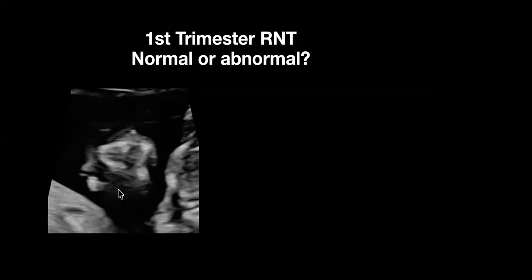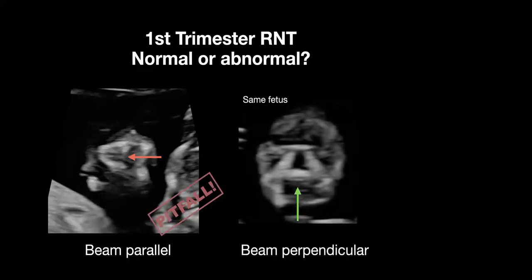And here it's kind of looking more of a coronal face. So of course, want to keep in mind that this beam is parallel. And this is actually a pitfall. And of course, when you're optimizing the view to where you really want to assess, and this is having the beam perpendicular to the primary palate, which is actually here, this is appropriate for assessing the retronasal triangle.